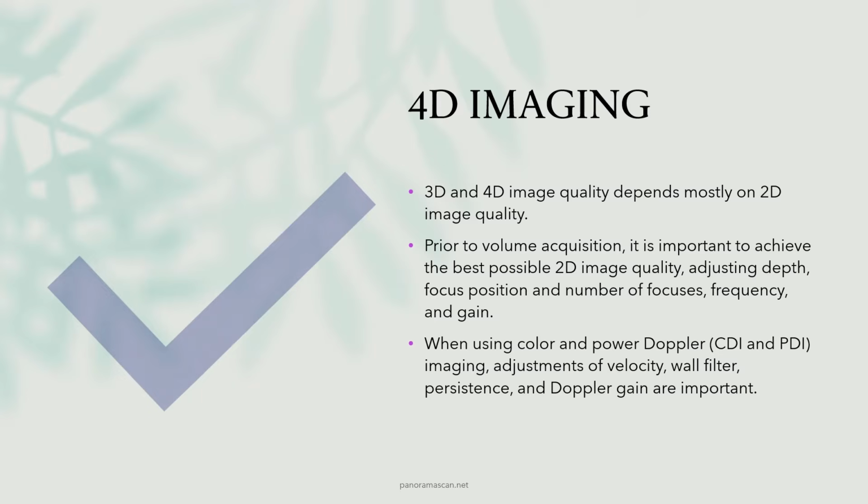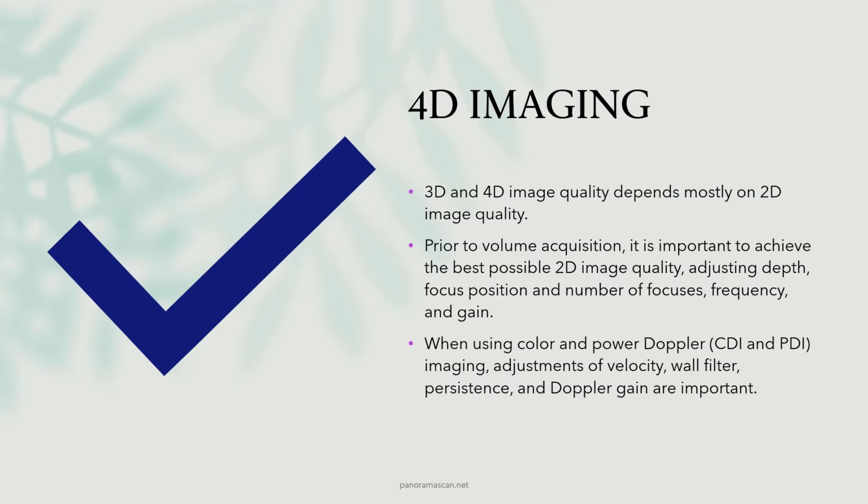By ensuring that these settings are correctly adjusted, you'll lay the foundation for high-quality 3D and 4D imaging. These settings not only improve the quality of the images but also enhance the diagnostic accuracy, making it easier to evaluate complex fetal structures, blood flow, and other anatomical details.